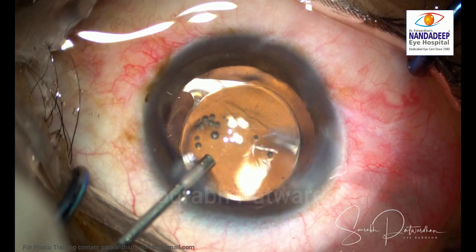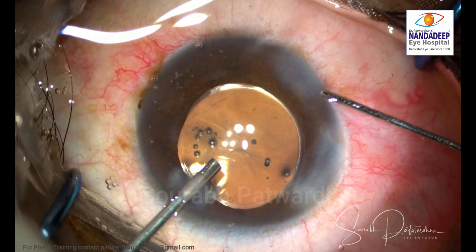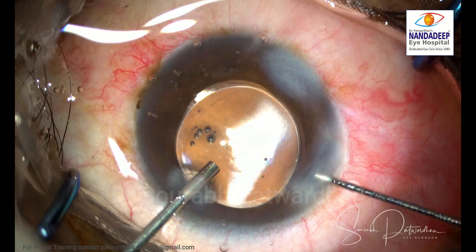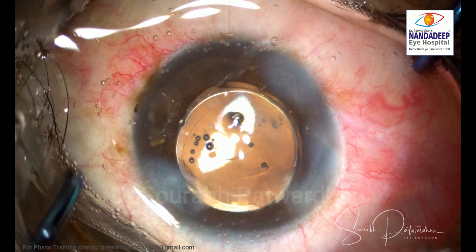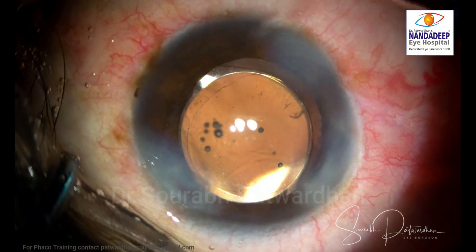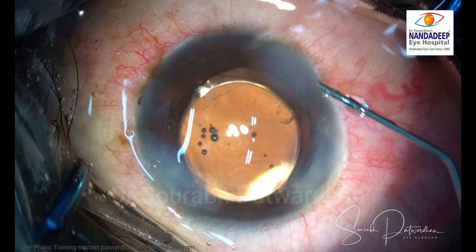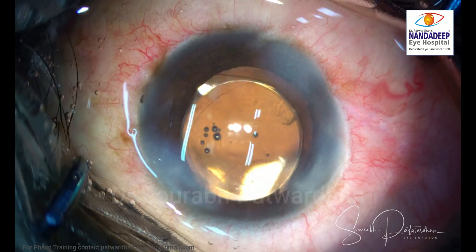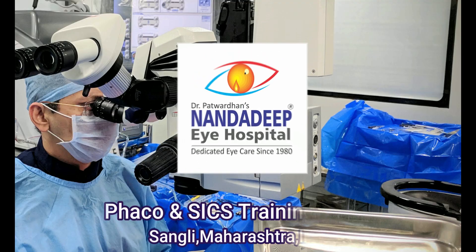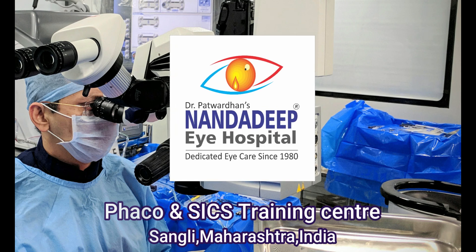I pushed some pilocarpine into the chamber to constrict the pupil, hydrated all the incisions, and made sure the anterior chamber is well maintained with no leakage from the wound — I don't want post-operative hypotony in this patient. That's the end of the surgery. I have given intracameral Vigamox, which is moxifloxacin, and the patient did well post-operatively.